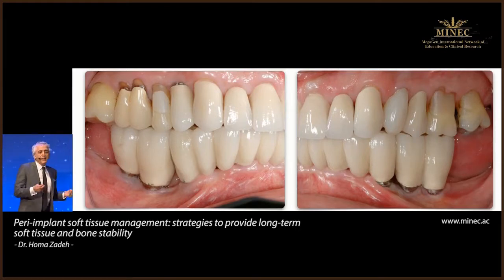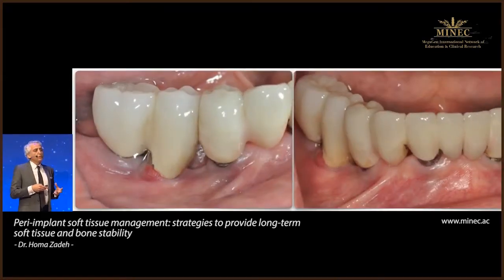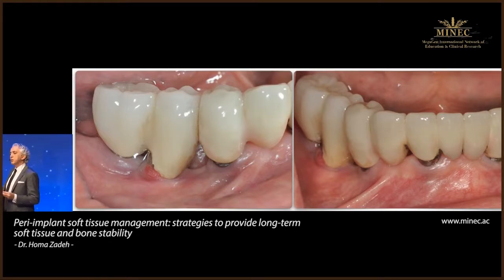So what I decided to do was the only thing that I knew what to do, which was to do soft tissue augmentation. And here you can see after 2 years, even the areas that he had clean, plaque-free presence, he was getting inflammation in those areas. Now I understand what the inflammation was coming from. Now I understand why there was bleeding in those areas, even when he didn't have a lot of plaque.